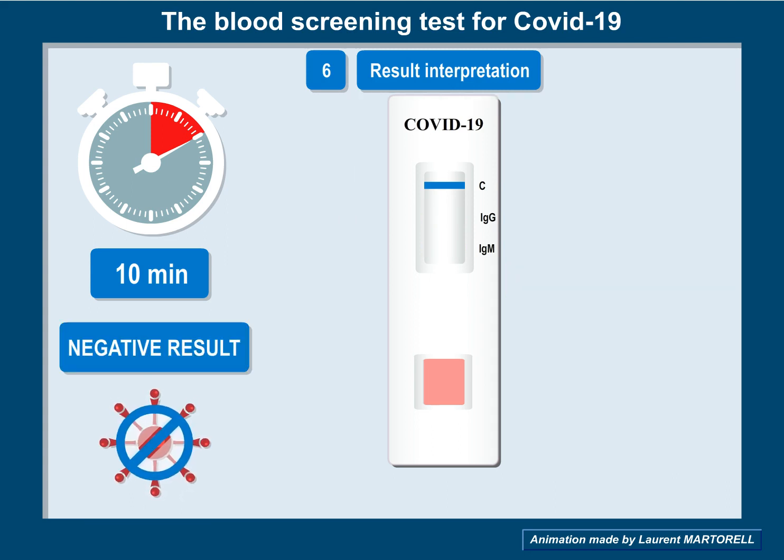If only the blue-colored line appears, the test is negative. You can assume you have not been infected by COVID-19.